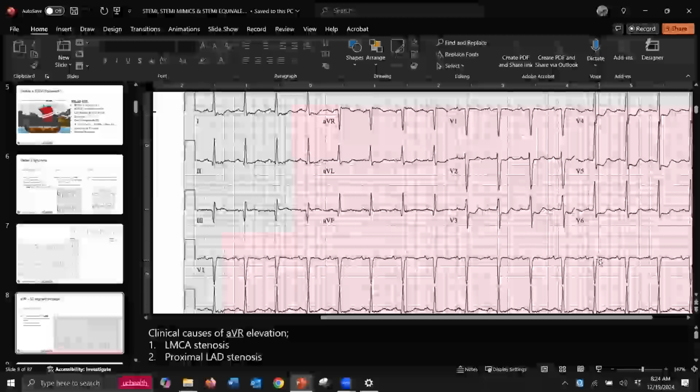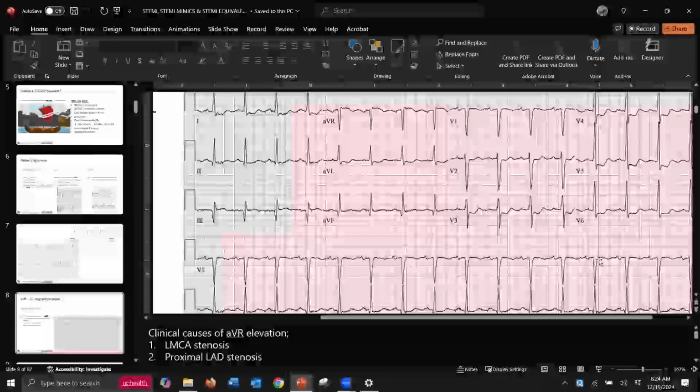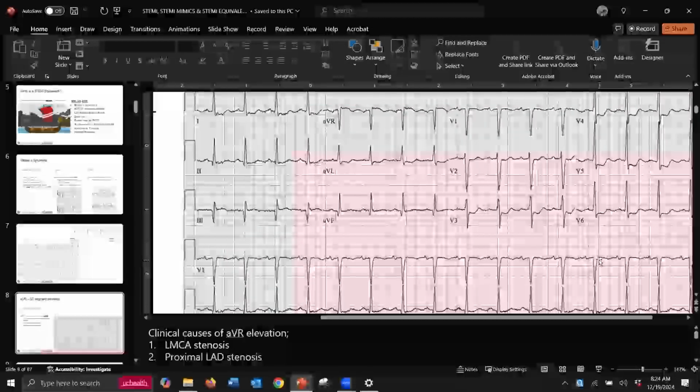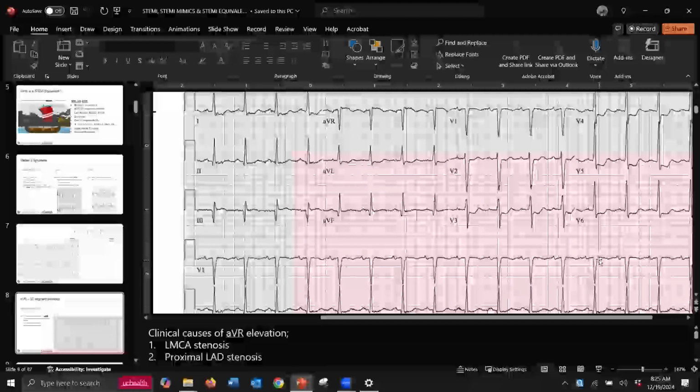If I call Dr. Farkas and I go, so Andra, I got this thing. She usually answers my calls sometimes. And I say, you got a really weird presentation here. It's just kind of vague symptomology, a little bit of chest pressure, no real increased work of breathing. They don't look like they're decompensating at this point in time. But here's my EKG. I got 1.5 millimeters of AVR ST elevation, and I've got massive depression throughout the precordial leads. And I've got reciprocation in AVL.